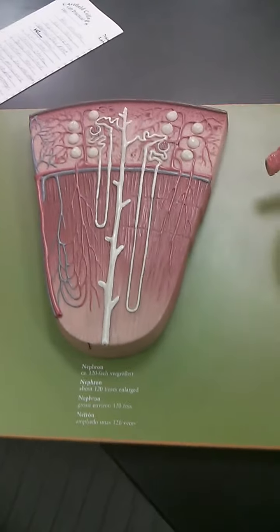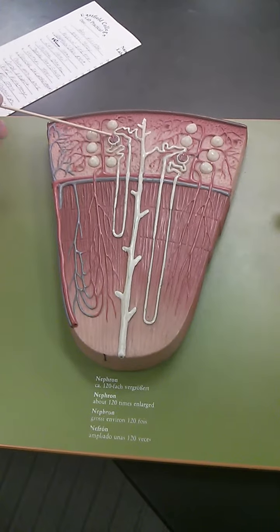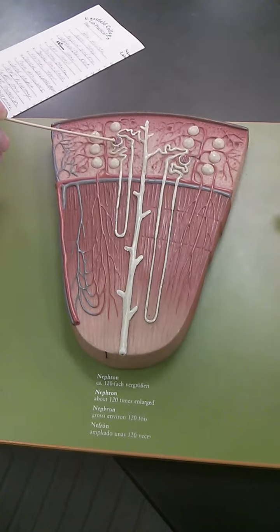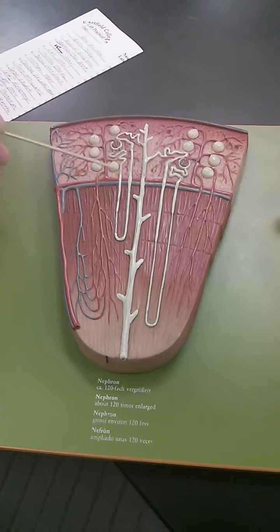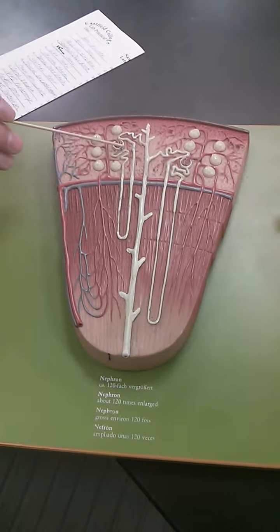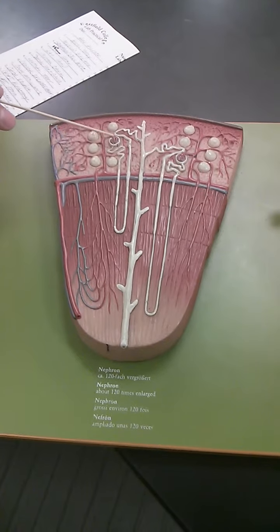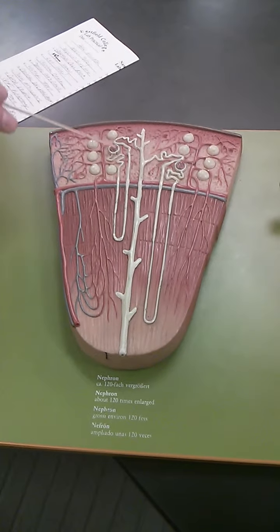Okay. Looking at the afferent arteriole, you see afferent arteriole coming into this glomerulus, and then it doesn't show you the efferent side. Okay, just the afferent side.